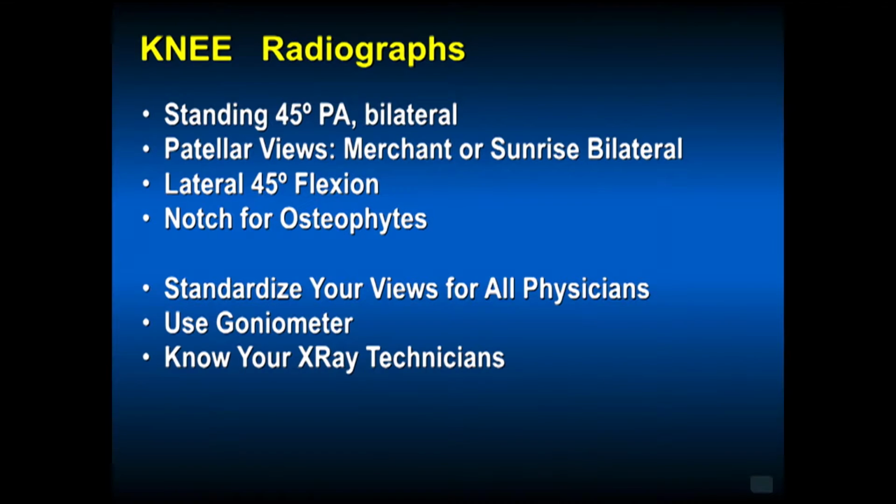Try to standardize the views for all physicians. Use a goniometer. Know and communicate with your X-ray technicians. They can really help you to make a diagnosis, perhaps on plain views with marked views. Sometimes you have to get stress views.